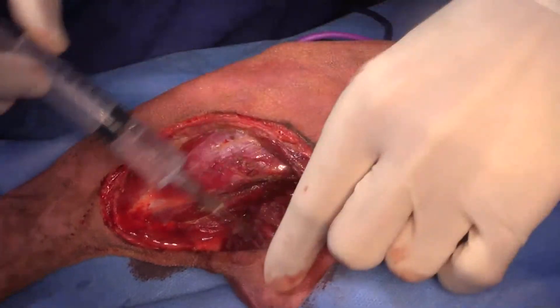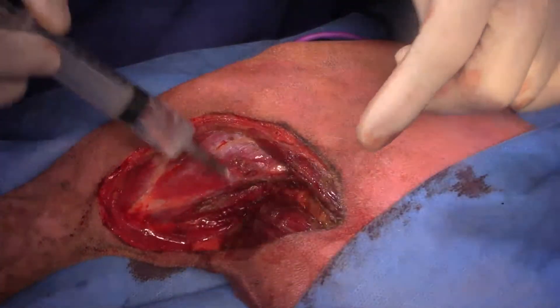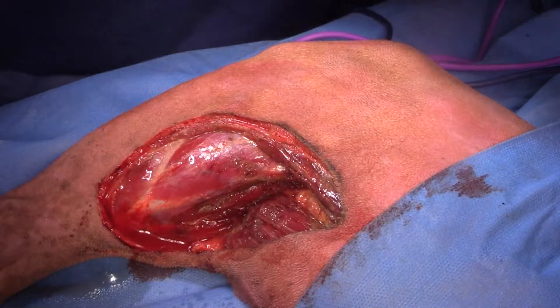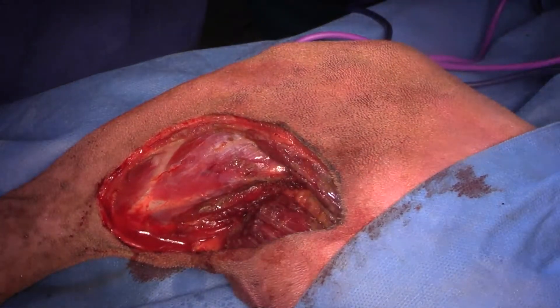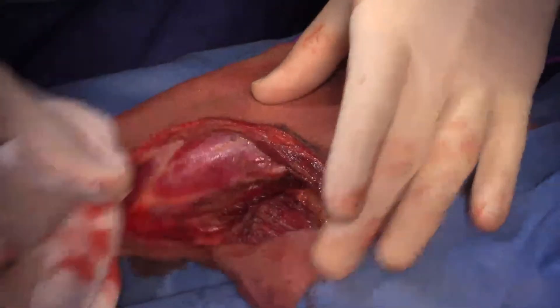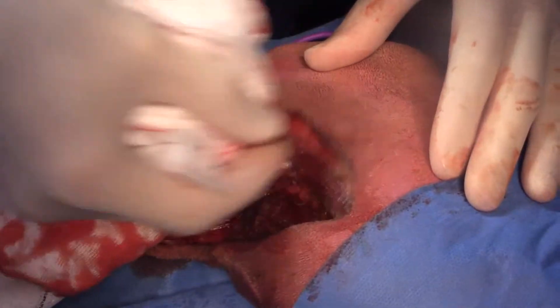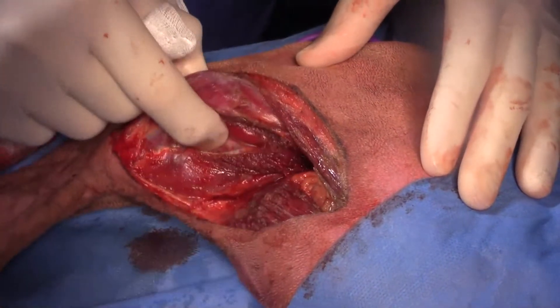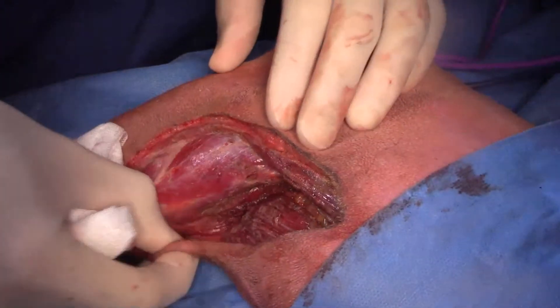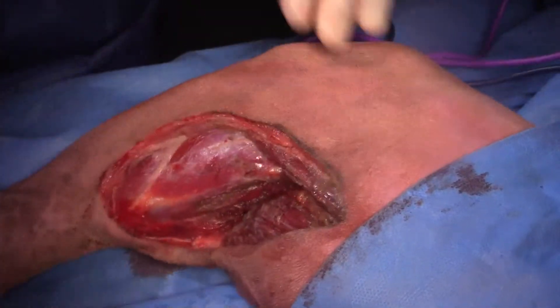Question about if the mass was larger, how much muscle could theoretically be removed. I've taken out a lot of the flexors before — you can take out quite a bit without any effect on function. You can take out the entire biceps muscle, definitely one head of the gastroc if not the majority of another half. Semimembranosus and semitendinosus you can definitely take out as well.